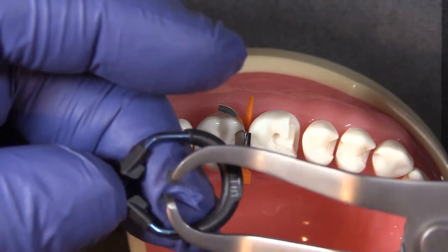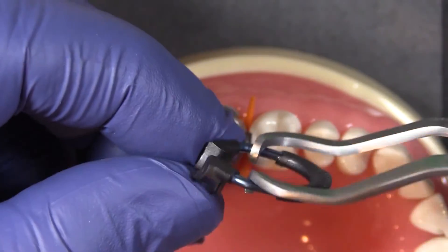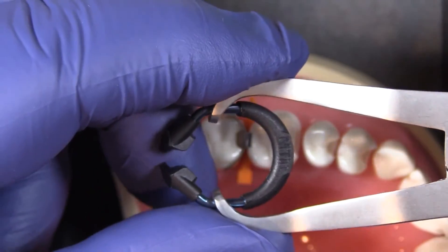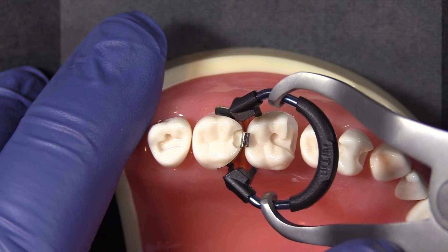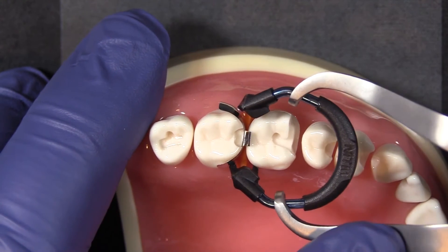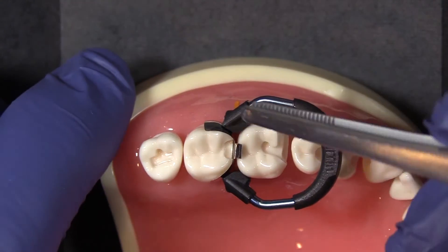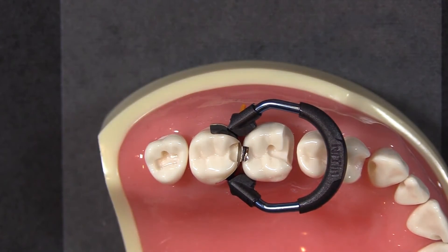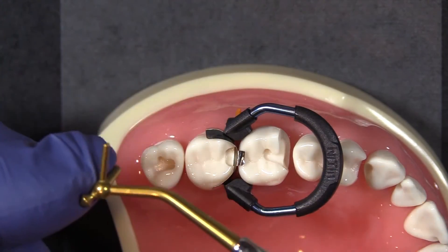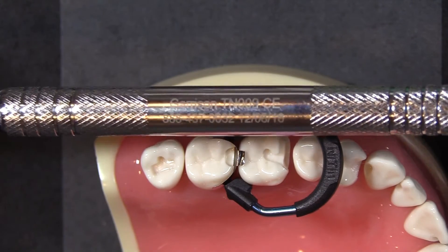I'm going to use the Nitin ring placement forceps. Grip the ring up on the metal portion — I'm using the taller ring because I've got a fairly tall tooth here. Don't try to grip it way in the back; grip it up towards the front to make the ring much easier to open. Slide it into the band, pushing the ends of the band out of the way, rotate it, and slide it down into place. Once everything is set, make sure the tab on top of the band is out of the way and give it a little burnish.